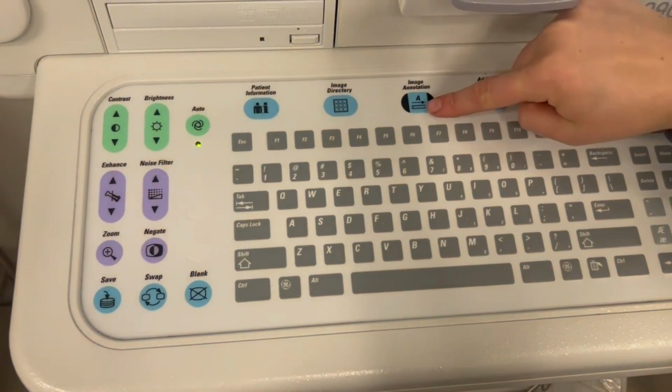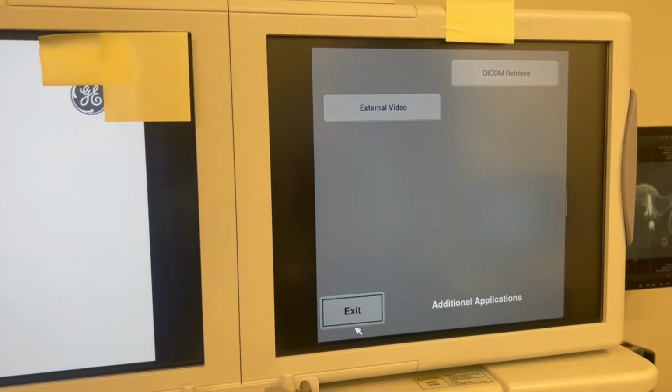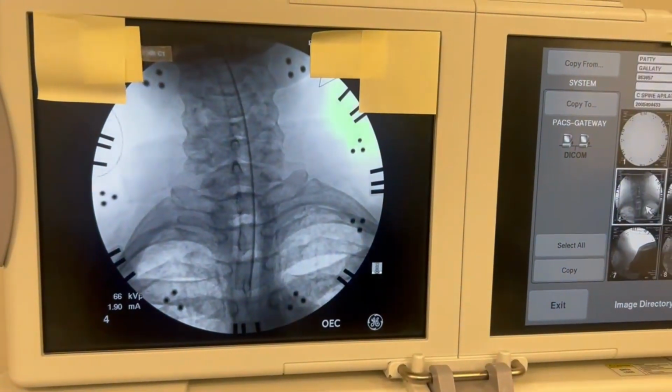The additional application button allows you to see other applications on the monitor. Image orientation is used to orientate the image in relation to patient position compared to the C-arm position.